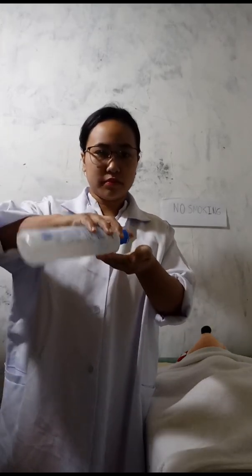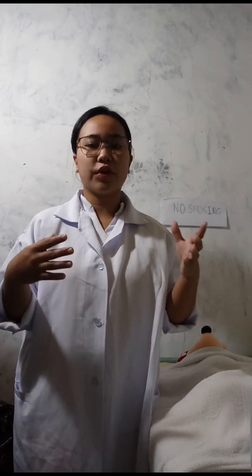Then, remove PPE if used. Perform hand hygiene. After performing hand hygiene, document. Put on clean gloves, remove and clean the cannula, and assess the nares at least every 8 hours or according to agency recommendation. Check the nares for evidence of irritation or bleeding.